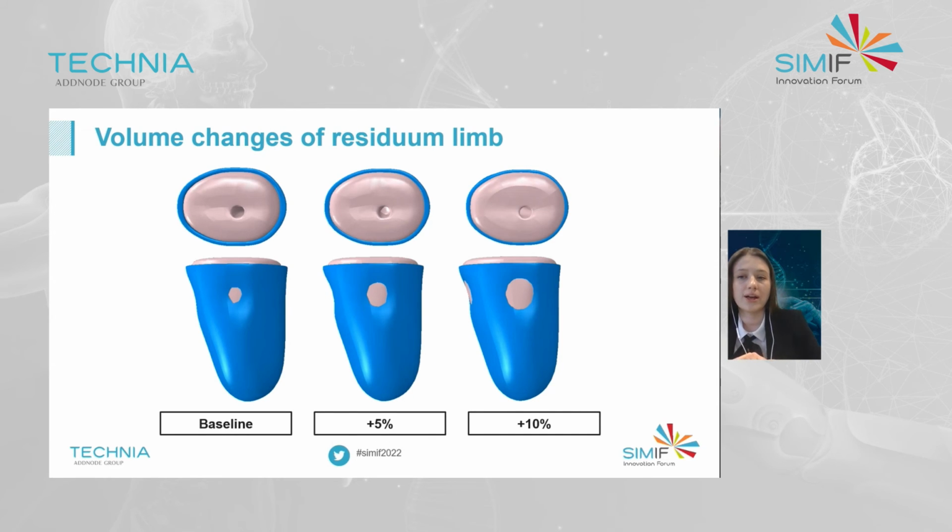The presented workflow enabled us to analyze and compare different designs of prosthetic socket in different loading conditions. Nevertheless, there is another significant variable in the field of prosthetic sockets on which we will focus in this part of the presentation. Changes in residual limb volume and shape lead to problems with creating and maintaining an accurate and comfortable fit of the prosthetic socket.